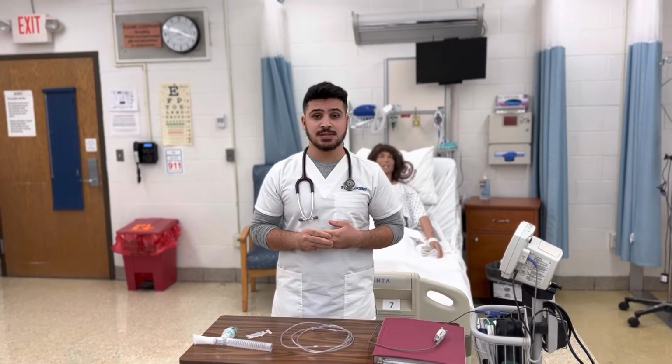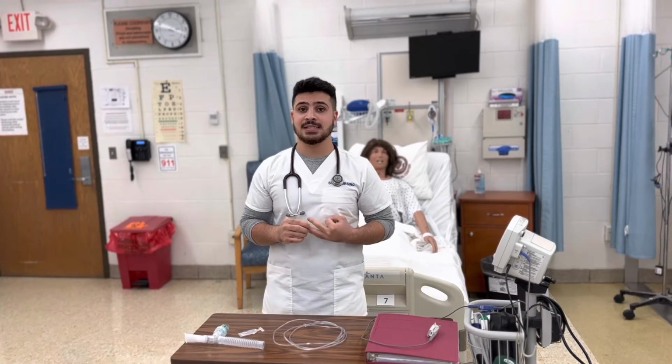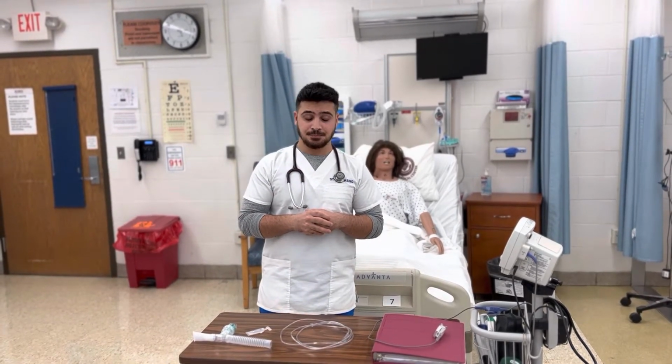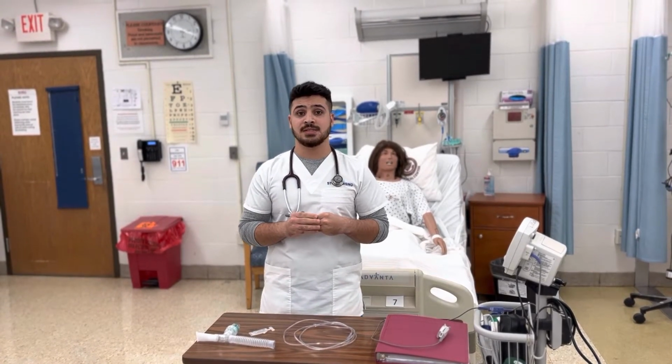In order to effectively and safely administer nebulizer treatments, you have to follow four steps: infection control, assessment, implementation, and education. For the first part, infection control, you have to wash your hands for at least 20 seconds to kill any microbes and pathogens on your hands before administering the medications.